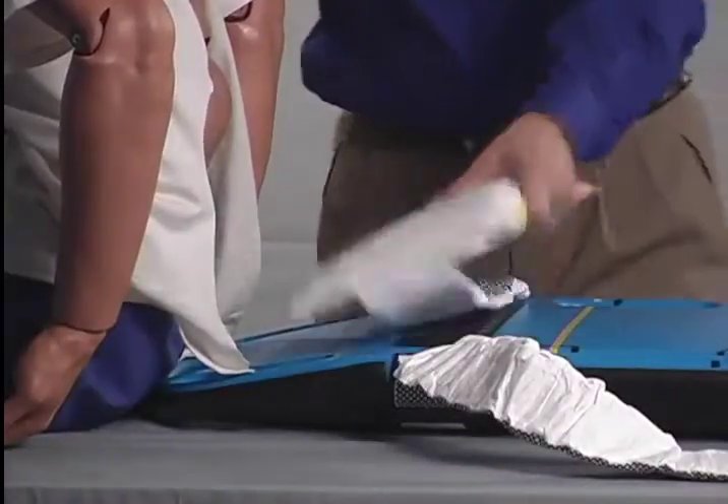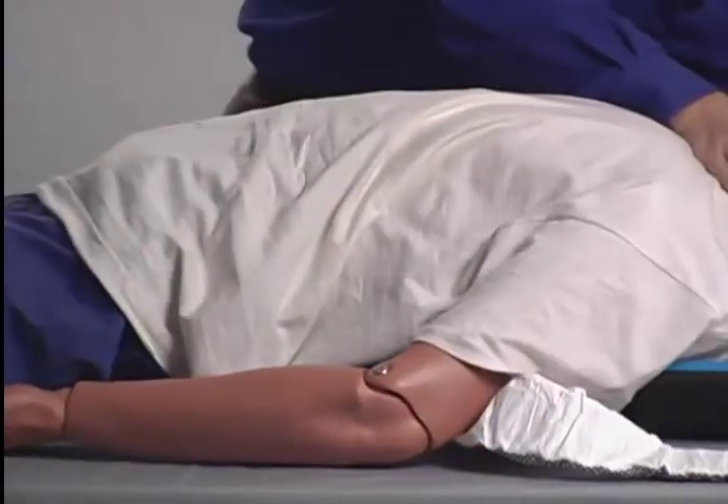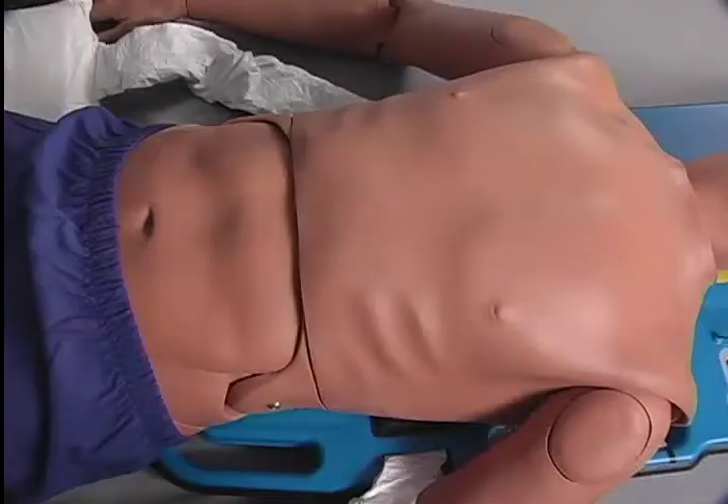Lay the patient back down on the board, ensuring the armpits are just above the yellow guideline. Remove the clothing from the patient's upper torso by pulling it down from the sleeves. It's important to remove all of the clothing from the patient's upper torso to avoid interference with device operation. In addition, the direct skin-to-board contact helps minimize the possibility of the patient sliding.